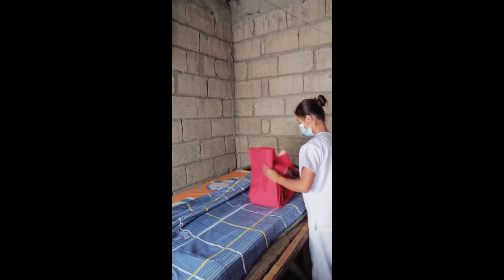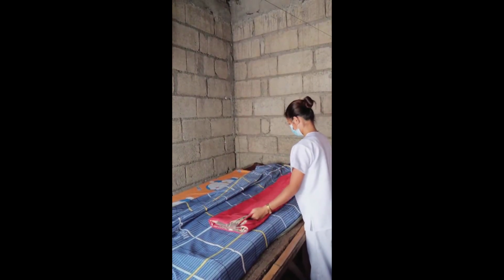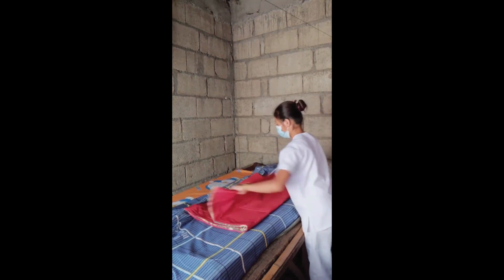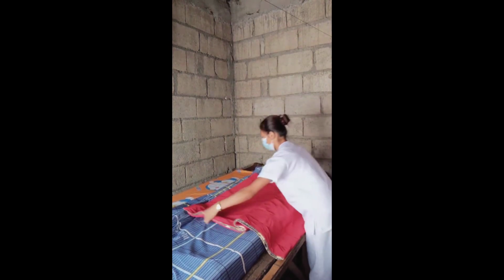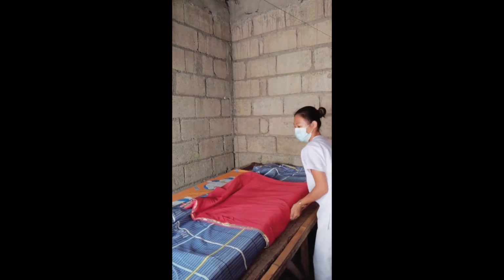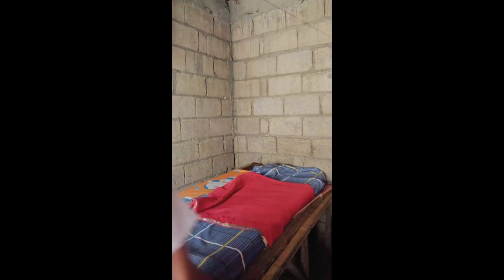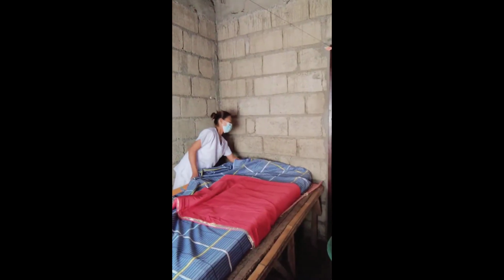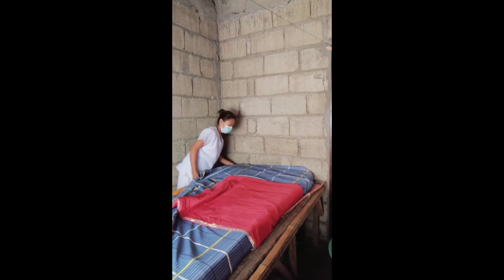If needed, apply a draw sheet. Lay it center fold lengthwise in the middle of the bed. Smooth the draw sheet over the mattress and tuck the excess under it. Now, move to the other side of the bed and spread the linen smoothly over the mattress edge.